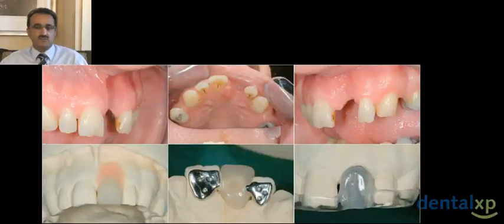Having a look at the patient, we always do the same sort of diagnostic steps. Now, of course, you take all the necessary radiographic and other examination that you need to do, but from a treatment planning perspective, we do a wax-up. We wax up the tissue that's missing, and we wax up the tooth to the contours that we think we want to do. We create a provisional restoration, and we like to use a Rochette bridge wherever possible, because it's easy to remove and replace.